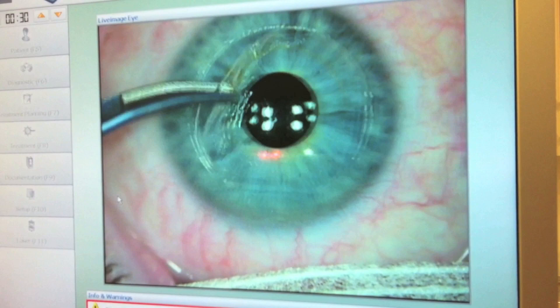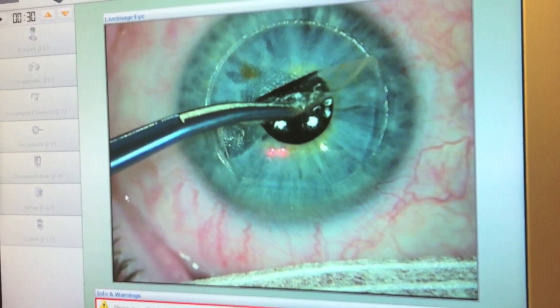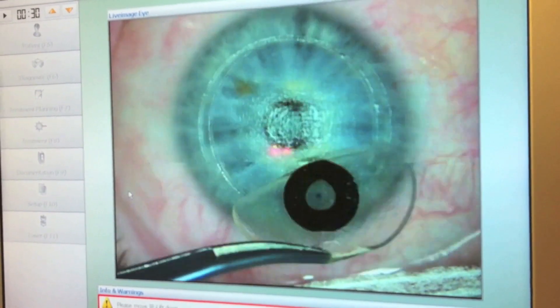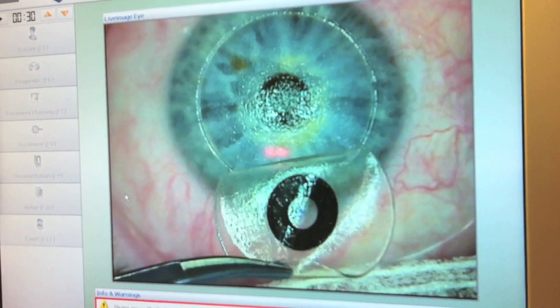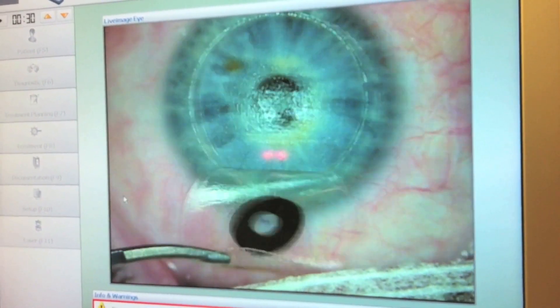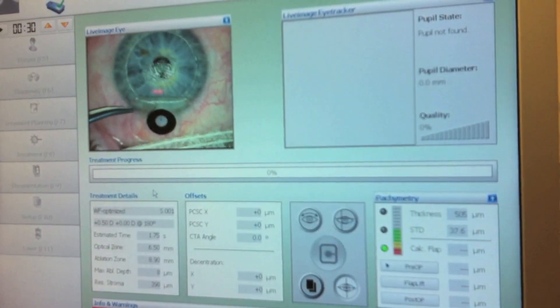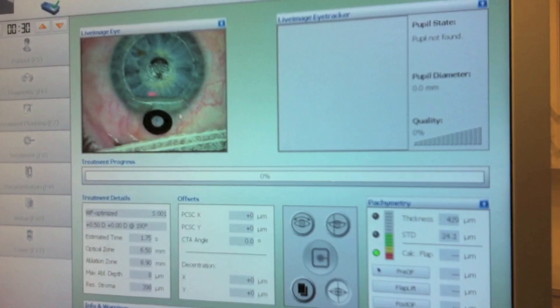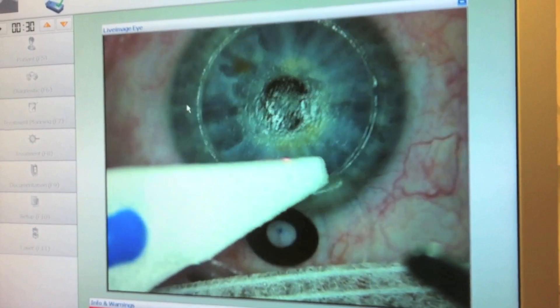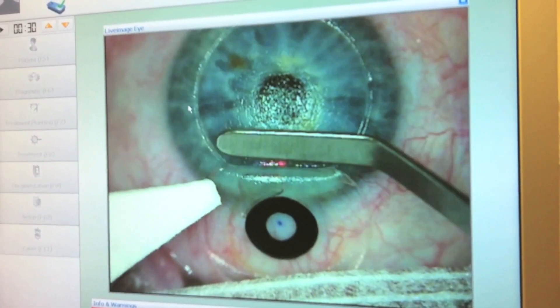Grasp the inferior edge of the flap with the forceps and lift the flap back in such a way as to encourage the inlay to remain adhered to the flap, by keeping it vertical as the flap over the inlay detaches from the corneal stroma. Once completely detached, place the flap onto the globe without folding the flap on itself. One can see the ink mark in the center of the inlay from the underside. Ensure the bed is dry and that there is no debris on the stromal surface.